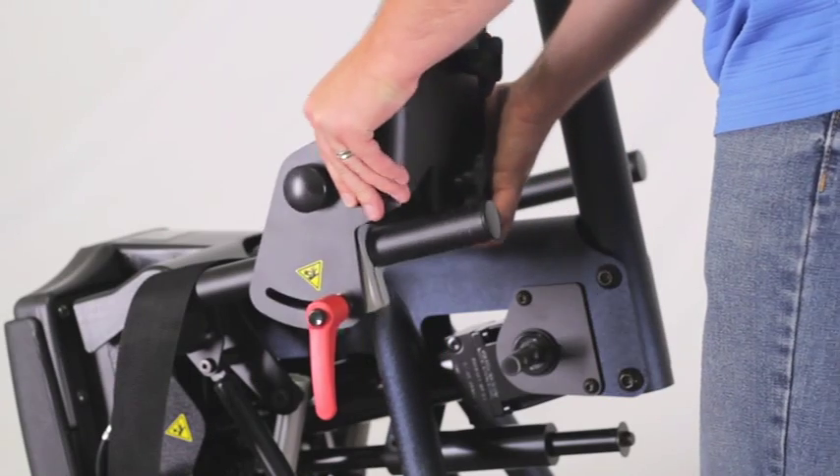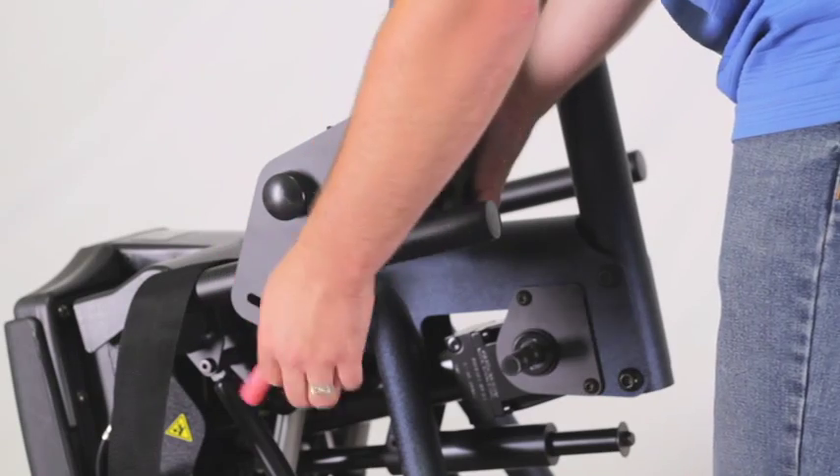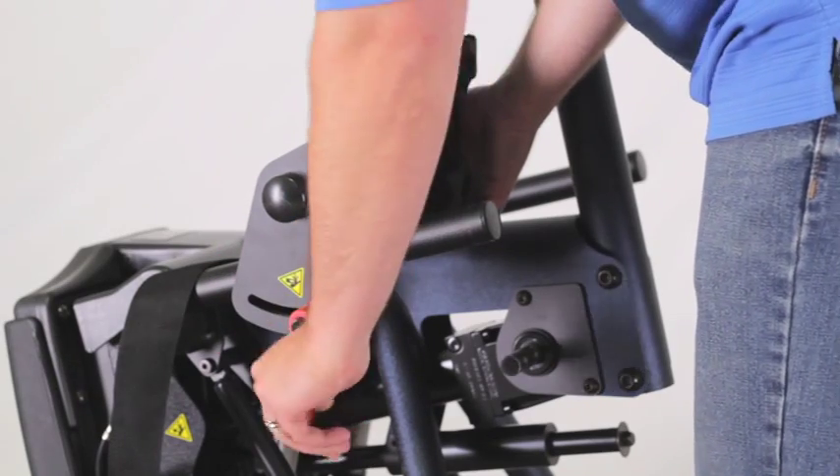Place both foot plates onto the unit with the red handle to the outside of the unit. Tighten the knob securely.